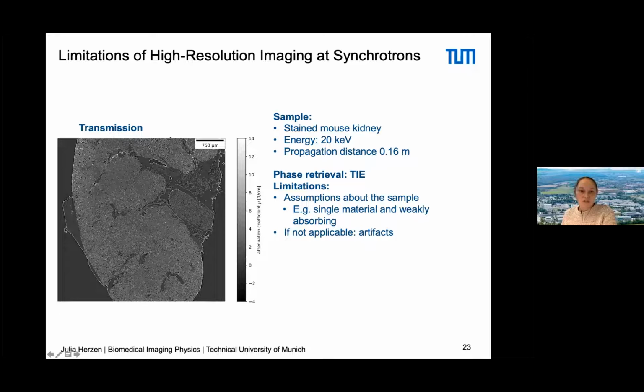This high intensity at all the edges maybe gives you higher resolution, but not the contrast that you expect or need. As I told you, what you have here is a mix of transmission and phase effect. So you need to perform some processing to get the phase information out of it. The mainly used processing is the transport of intensity equation.